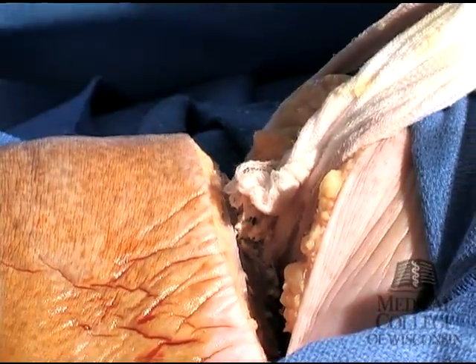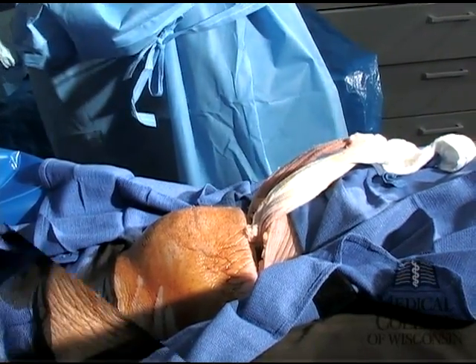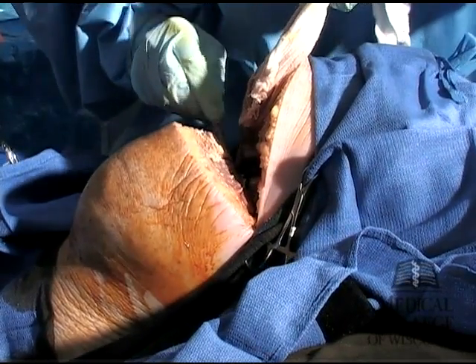Once you have cut through the bone, place the safety back on the saw and put the saw down. With a Mayo scissors or scalpel, cut through the remaining tissue.